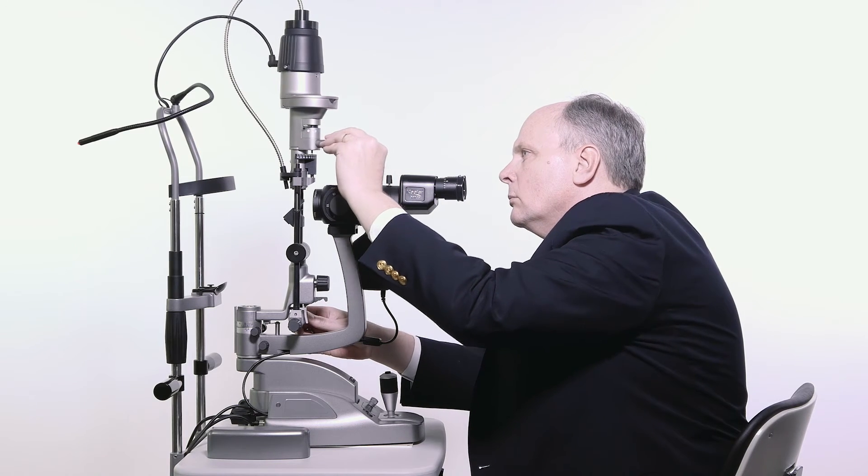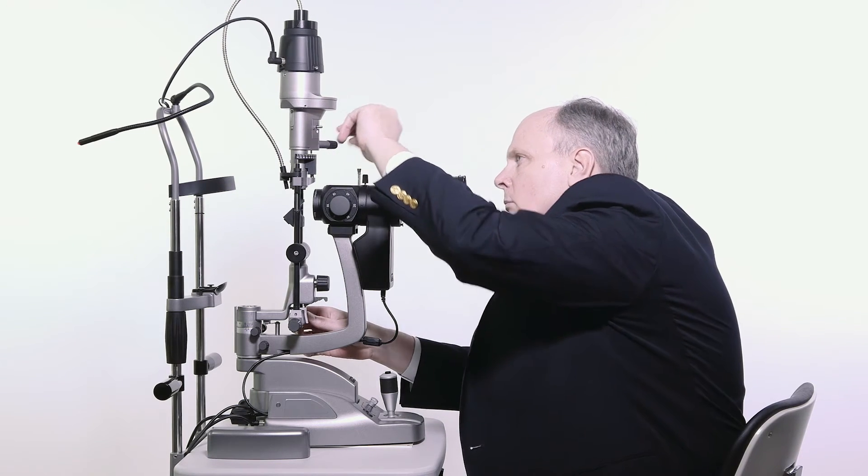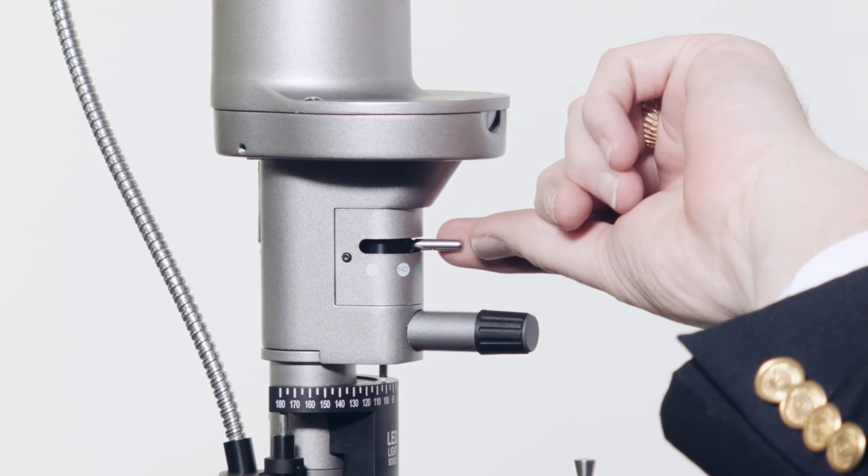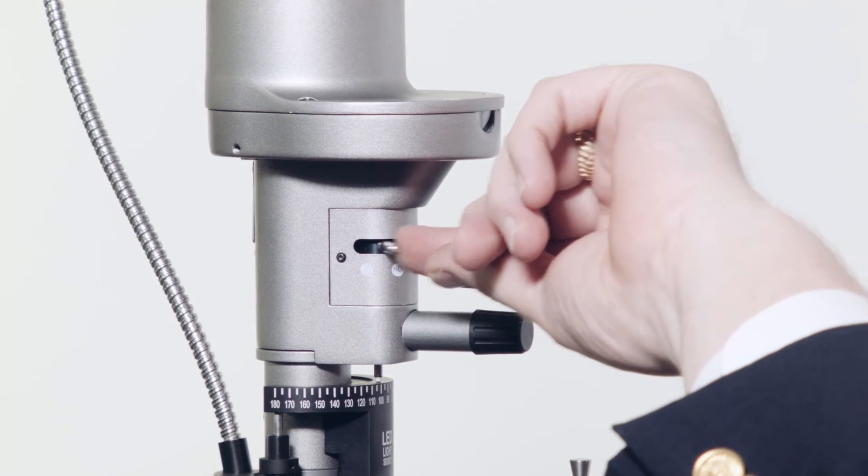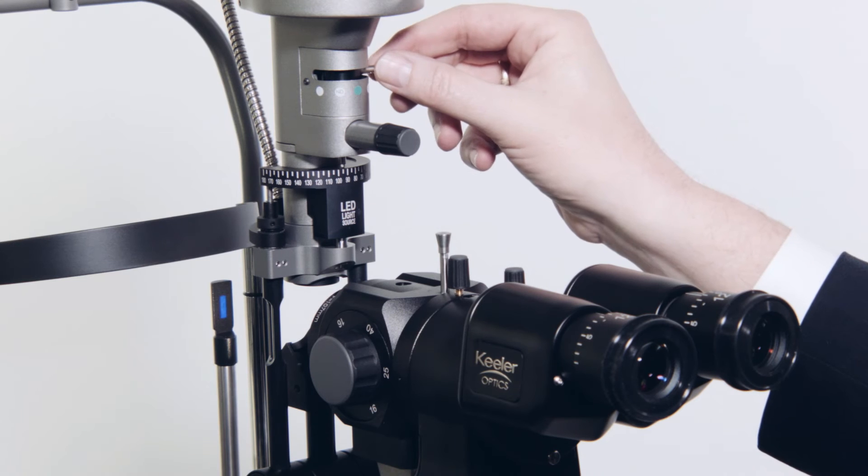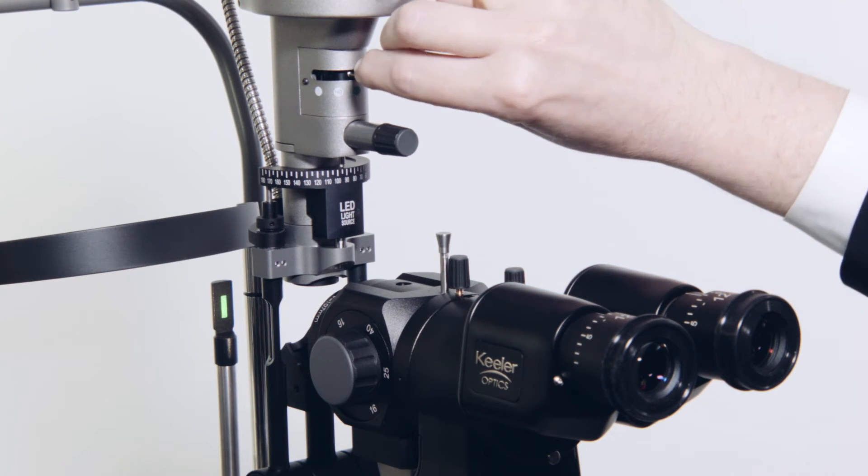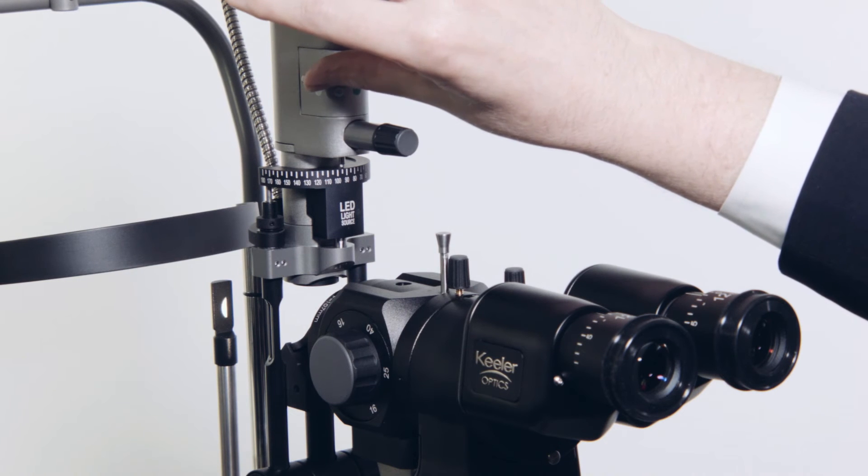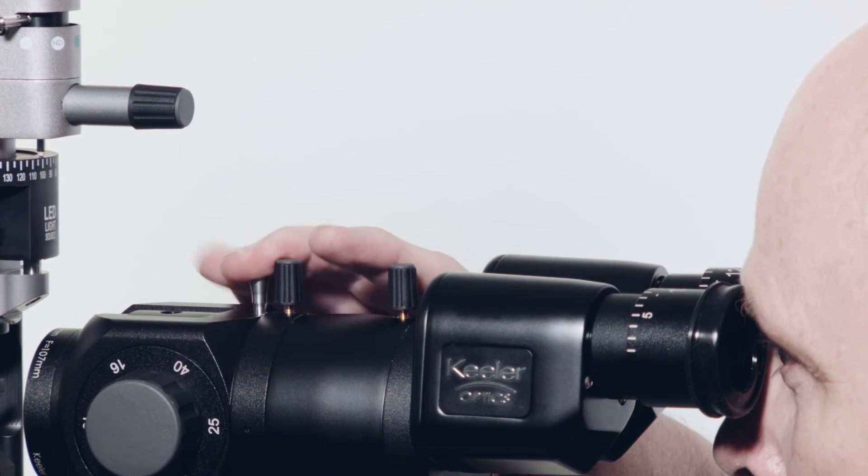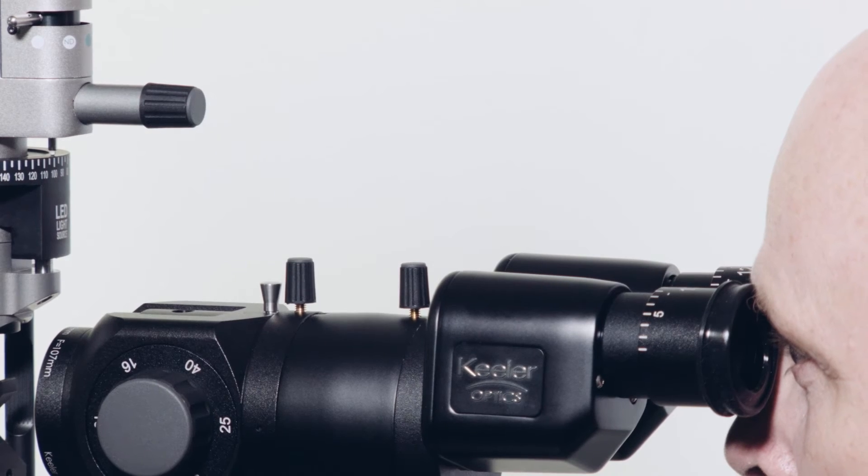Slit angle can be adjusted as required to perform the examination. The Q series slit lamp offers a full range of filters required for examination. These filters are blue, red free, yellow, clear, and neutral density diffuser. The yellow filter can be inserted and displaced by using this plunger.